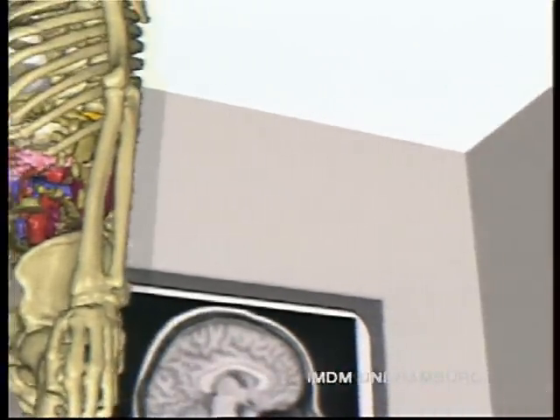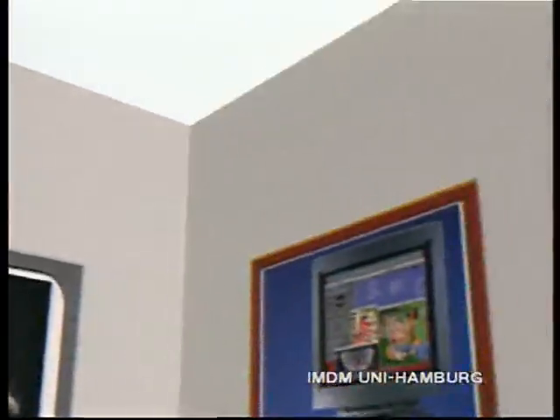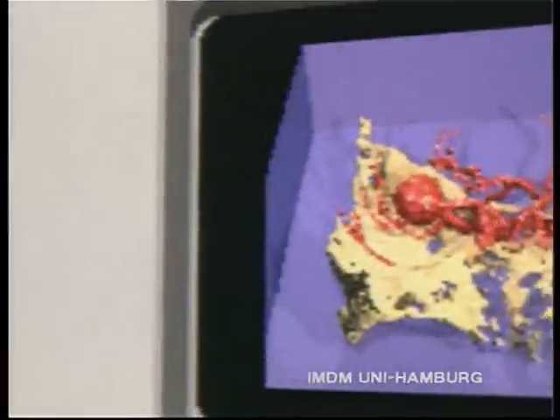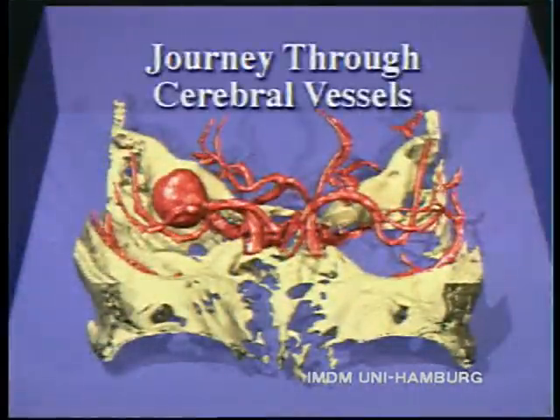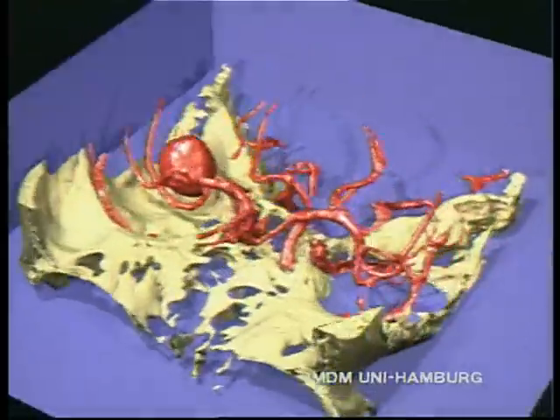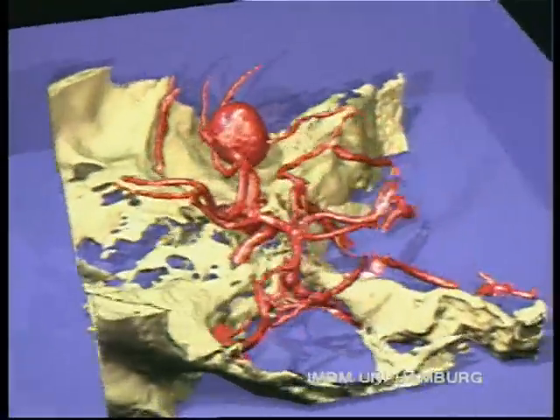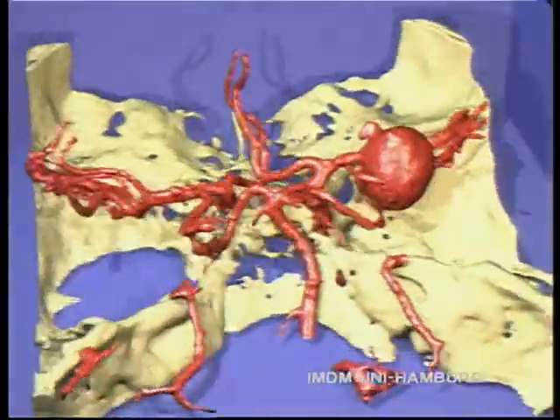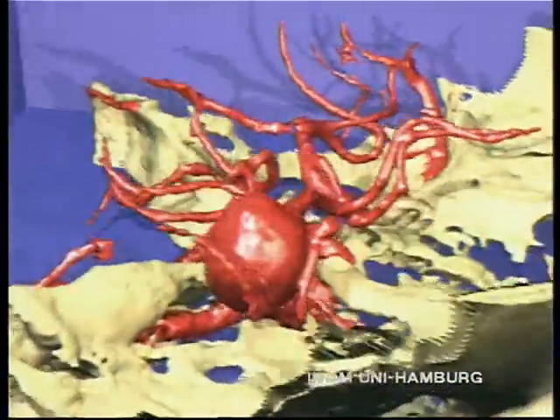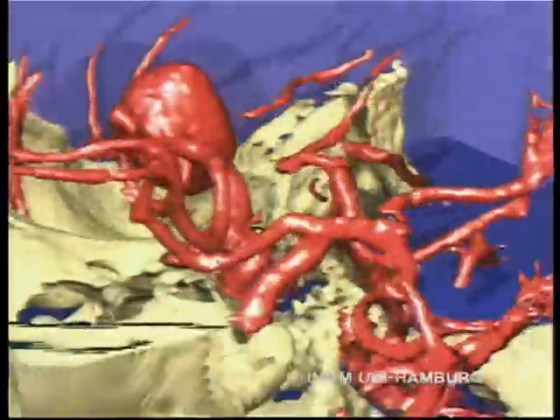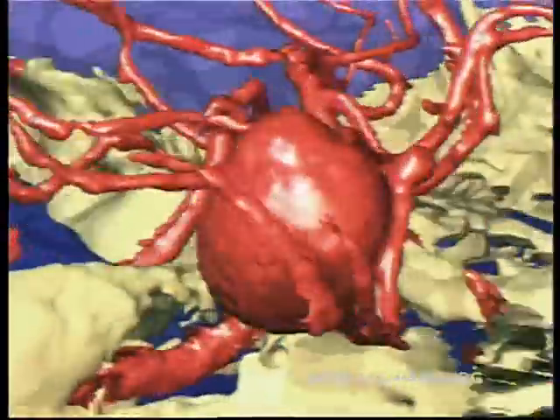As a further step into smaller structures, the virtual body offers novel possibilities of vascular imaging, as shown with this aneurysm of the right middle cerebral artery acquired with CT angiography. Its morphology may be assessed from any direction.